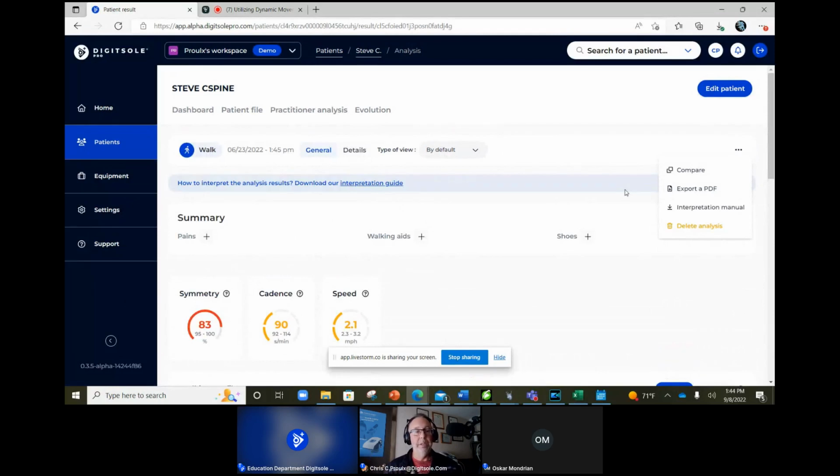You can input some of the information in there, and it allows you to share the information again with the patient, with another practitioner, maybe you're co-treating or referring them to, or the caregivers, to show that here's what's wrong with the patient, as well as some of the things that are changing as a result of the treatment effect, and whether or not they need to come in, or maybe they're going to be discharged.